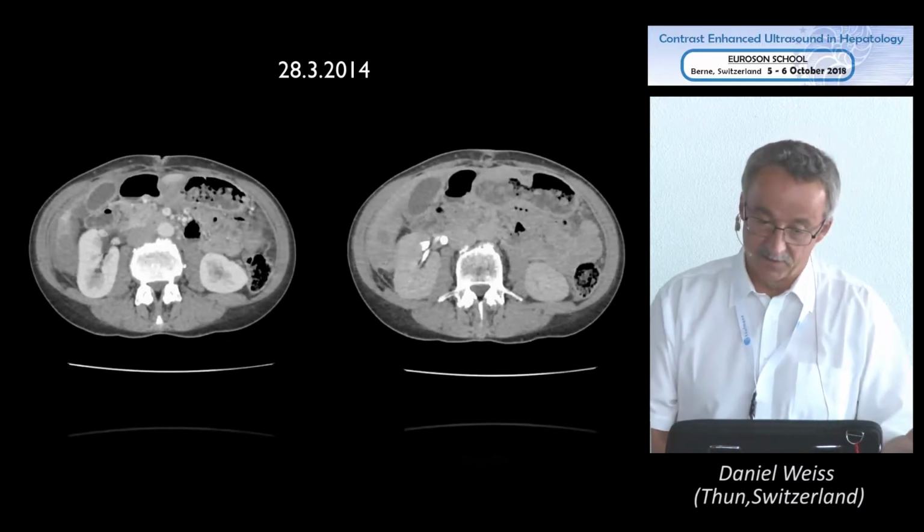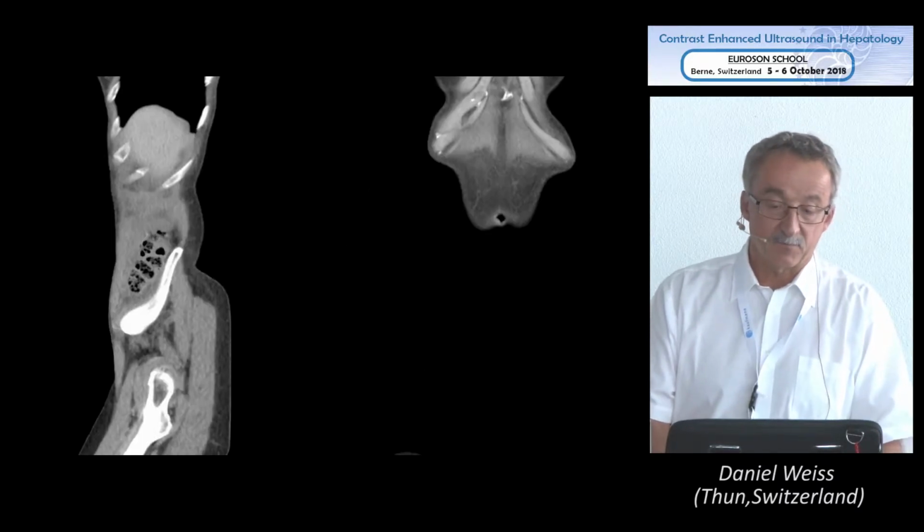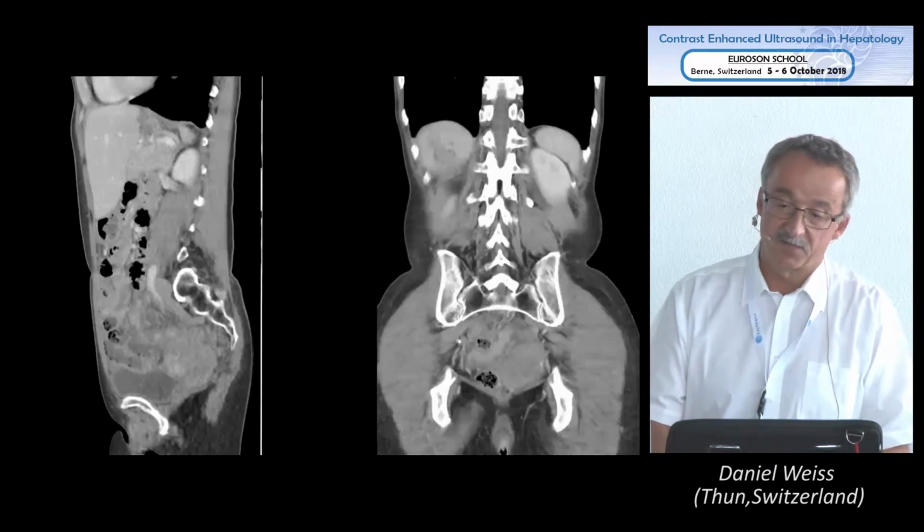It's very difficult. It's always difficult to say something when you have such a destruction in the liver.